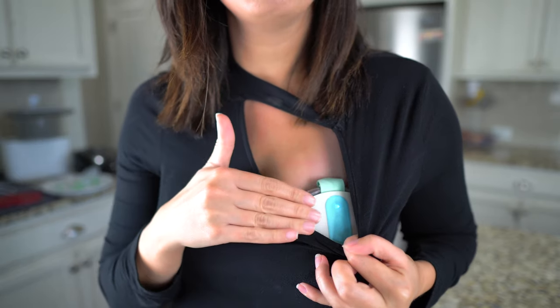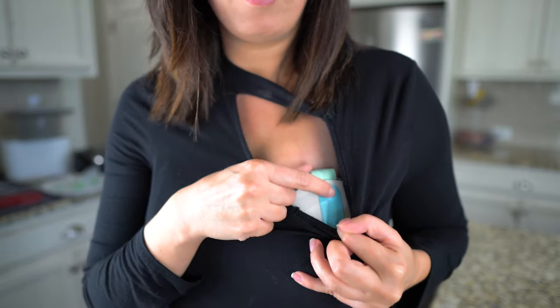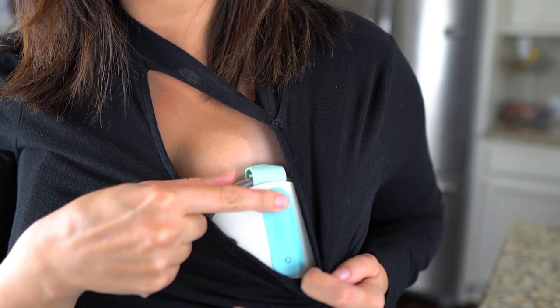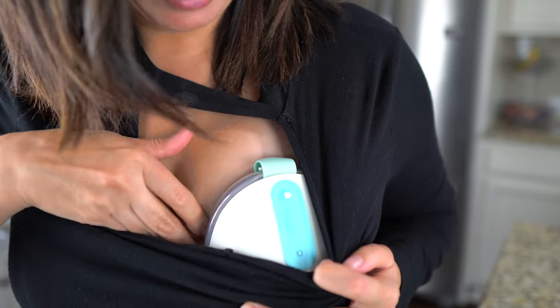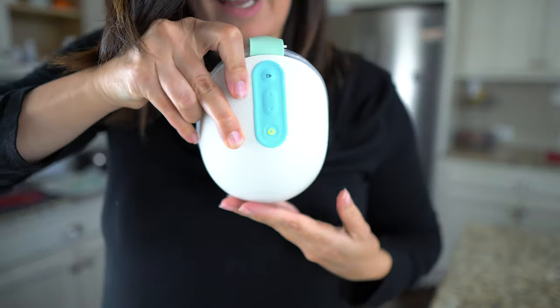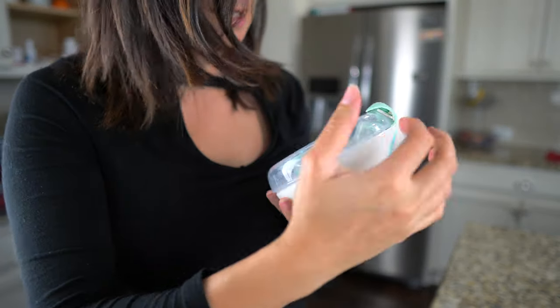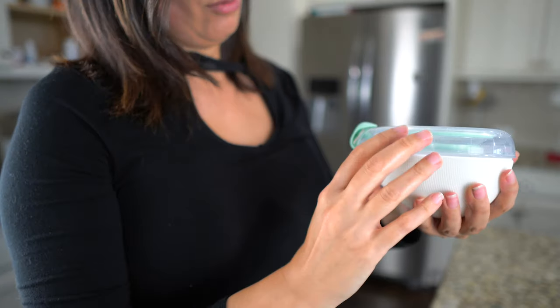Once you're in stimulation and eventually in expression mode, push the pause button and switch to setting two. Then you're going to need to unlatch. It lights up in white. Unlatch and make sure you don't spill milk. Keep it slanted forward as you take it out so the milk inside doesn't spill.